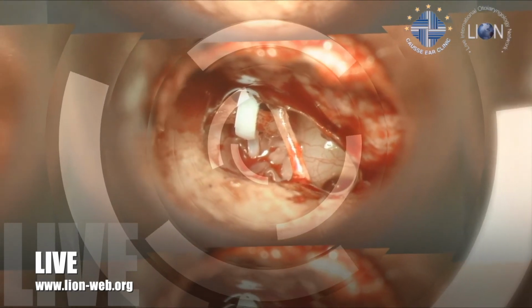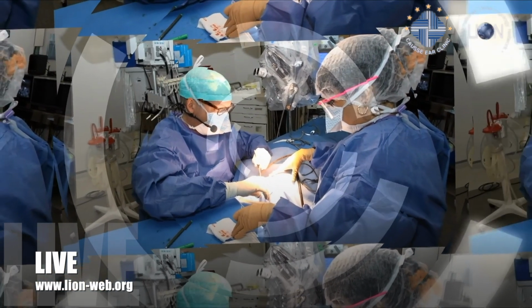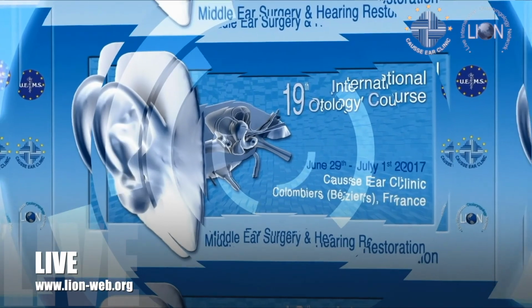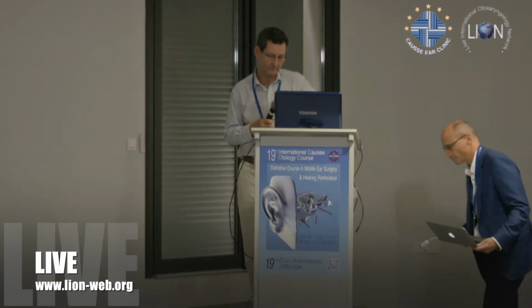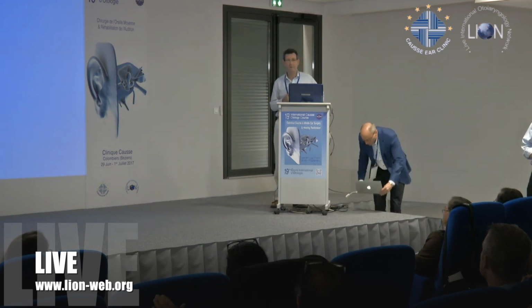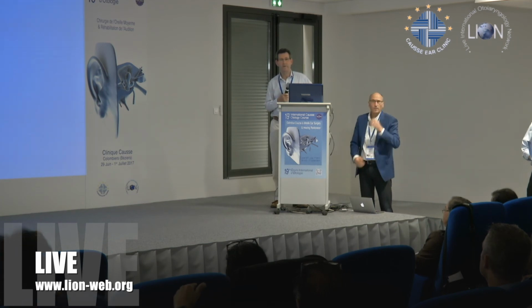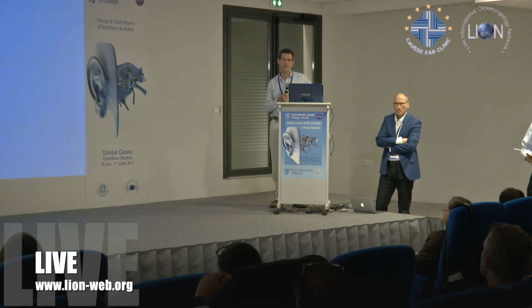Thank you, Rob. That was a fantastic overview. Really enjoyed it. I worked a bit with Cochlear in our lab developing some of the early piezoelectric stuff, measuring bone conduction. We know that any passive device with skin in between will drop the high frequencies, just because that's what skin does. It's a compliance in the system. So any active device, either transcutaneous or implanted active, will do better in the high frequencies than a soft band or anything that goes in a tract. So it was interesting seeing comparisons of the new device versus a soft band, but we'd expect it to be better than the soft band in the high frequencies.